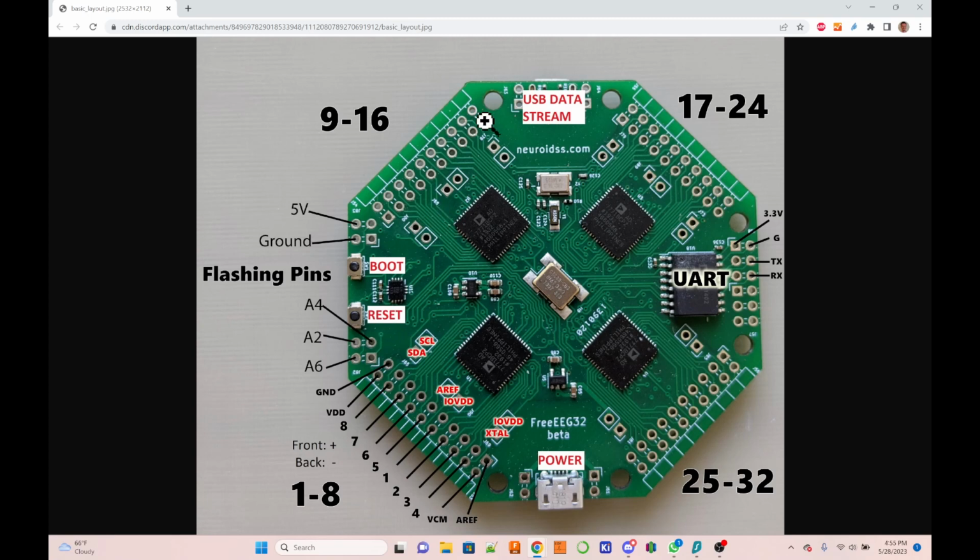Then also on every block of pinouts for every ADC, there is a power supply, if you wanted to use active electrodes or do something else, and that is VDD and GND. VDD is the plus, and that gives 3.3 volts, and that every time is on this position, and that rotates also. So here, and here, and here, and here. And then the ground, the negative terminal for that, is here, and here, and here, and here.